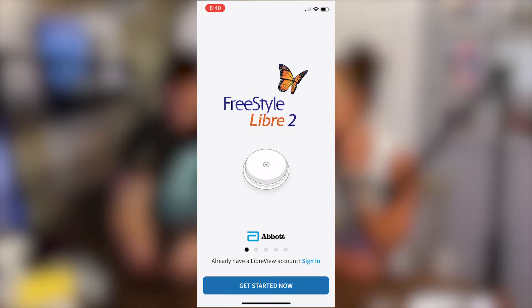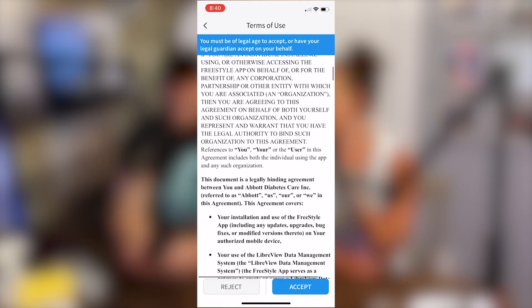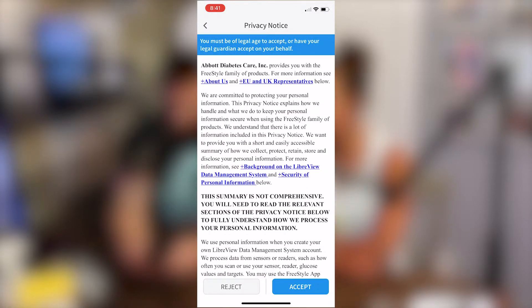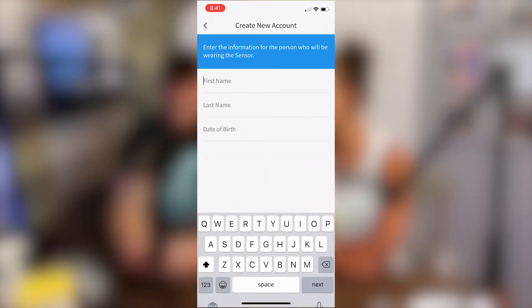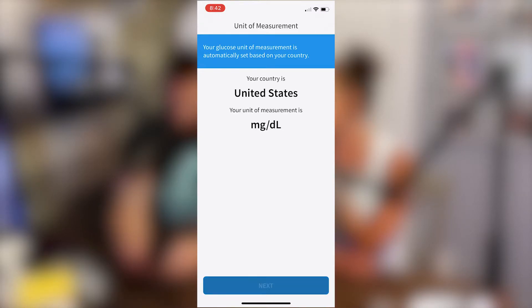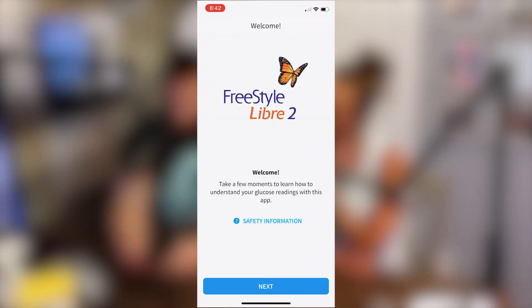You can hit 'Get Started Now' and it gives you some warning stuff. Select your country — United States. You can read all the terms or just hit accept. There are a bunch of other disclaimers and HIPAA notices. Then create an account — select United States, choose milligrams per deciliter, and grams. Then it welcomes you to Freestyle Libre 2.